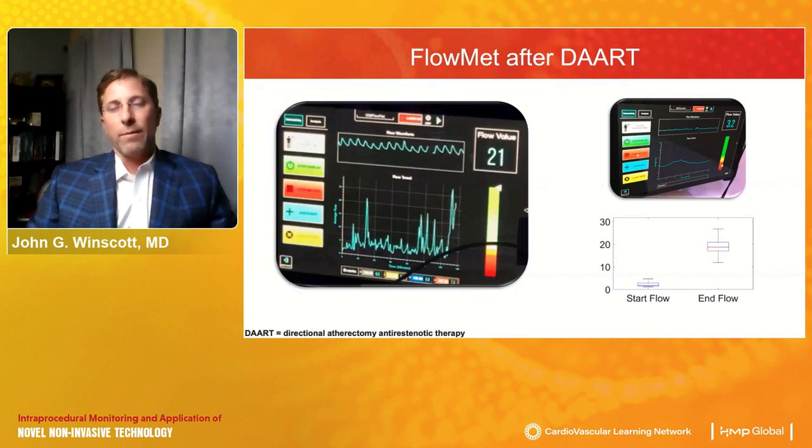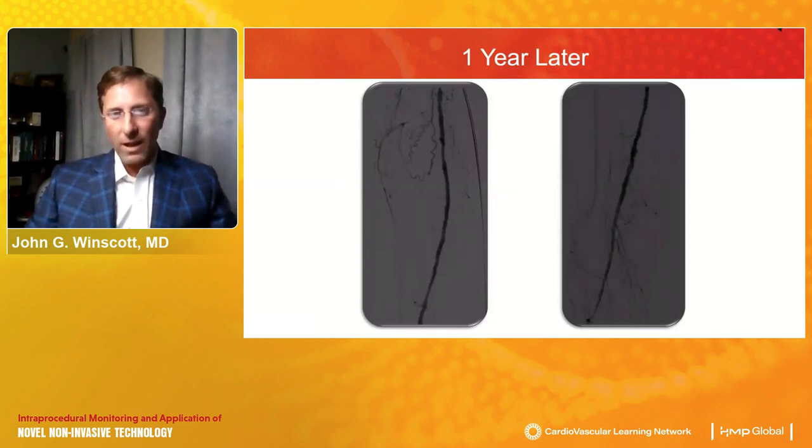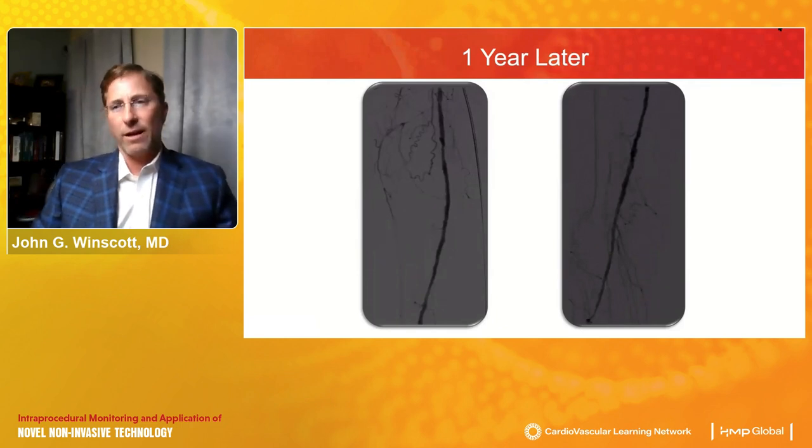And actually, amazingly, he came off of home oxygen about 6 months later, was able to participate in cardiac rehab and pulmonary rehab, and has done much better. And in fact, after a year after this procedure, he was having some angina and came in for a heart cath, and I convinced one of my partners to shoot a picture of his leg while he was in there 1 year later. And you can see 1 year later, we still have a widely patent vessel in the fempop segment. And I don't have the entire angiogram here, but he still had those very robust collaterals in the proximal tibials and at the ankle.